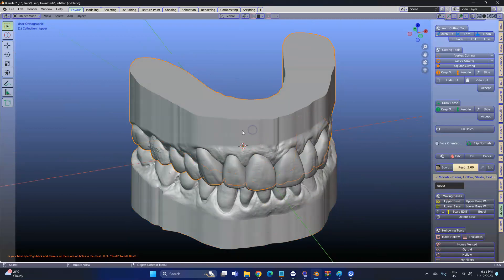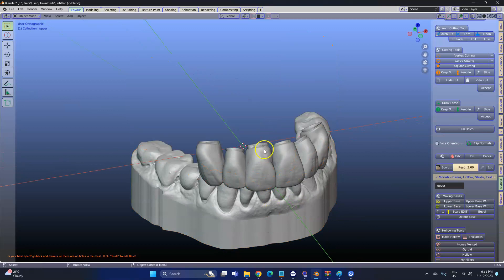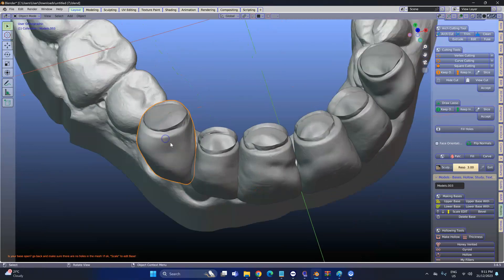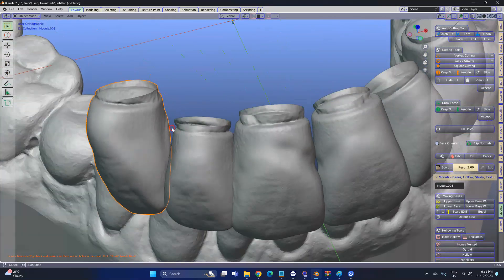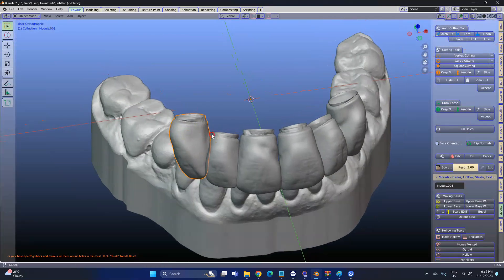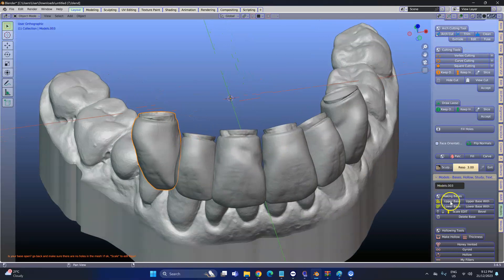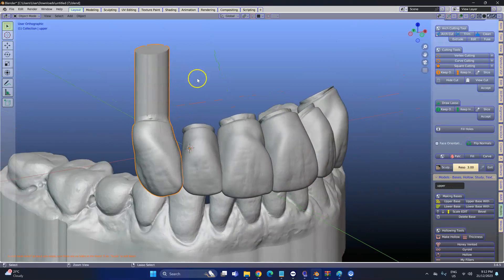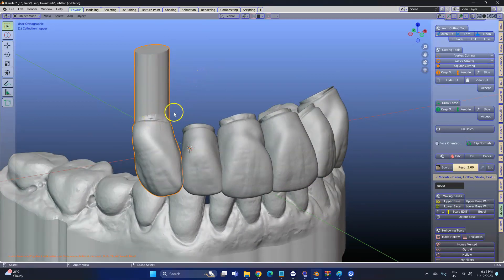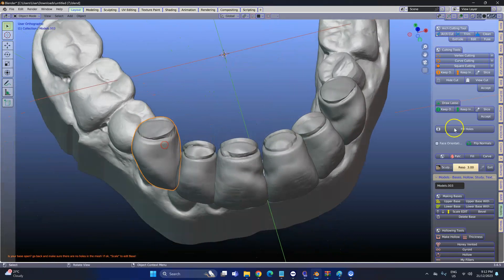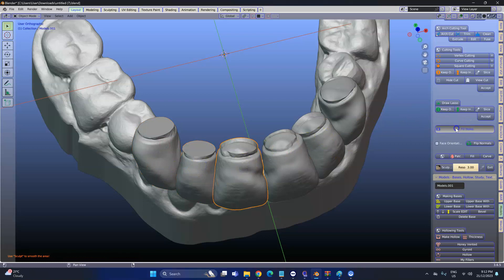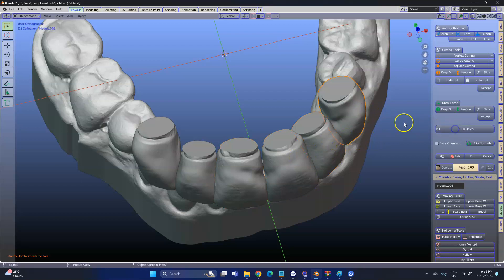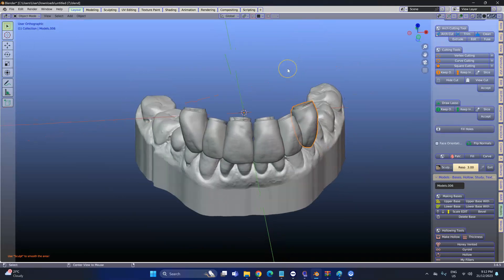Now what we want to do — select this one, press H to hide on the keyboard. You see you've got all of these open, and all of them have to be closed. So we're going to click on Fill Holes. Here — Fill Holes, select Fill. This is going to make a solid mesh structure. Then press ALT+H to unhide.